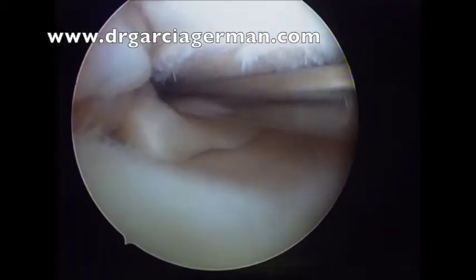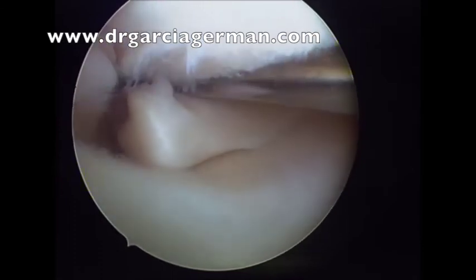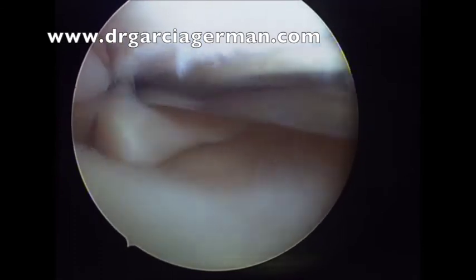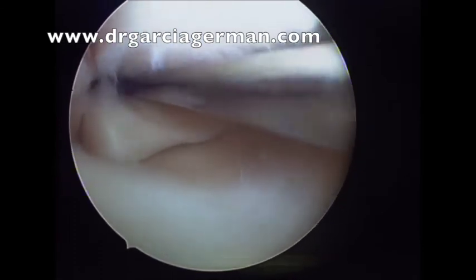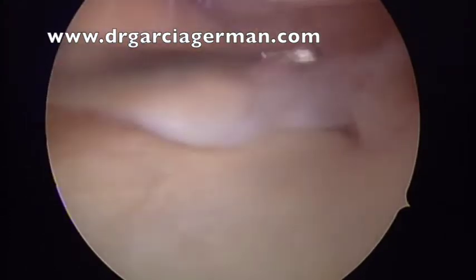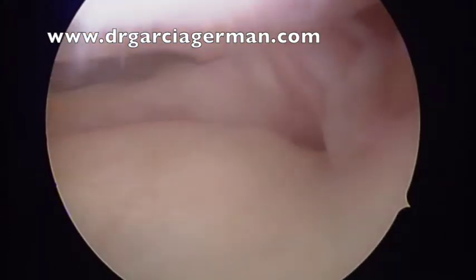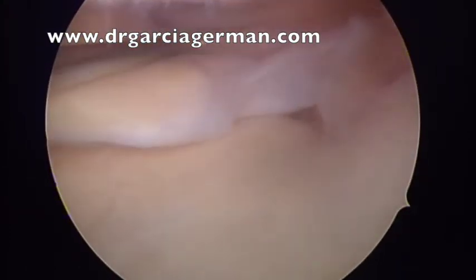When we scope the knee, we can see there is a stump in the posterior root of the medial meniscus and there is no continuity between the posterior horn and the tibial plateau.